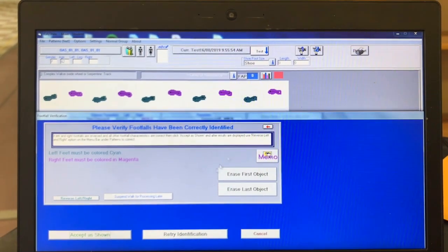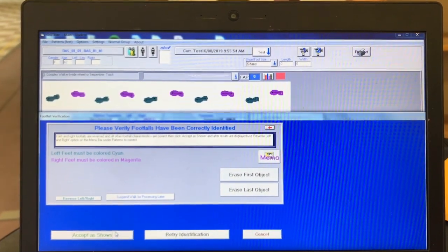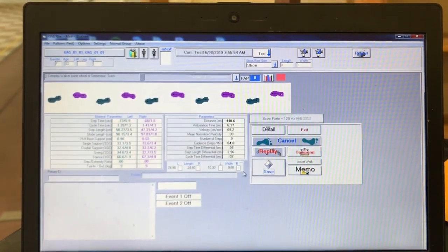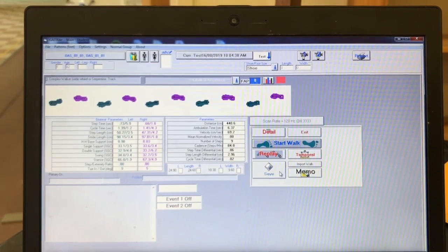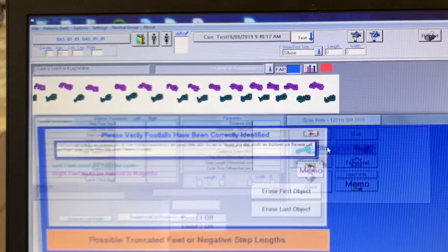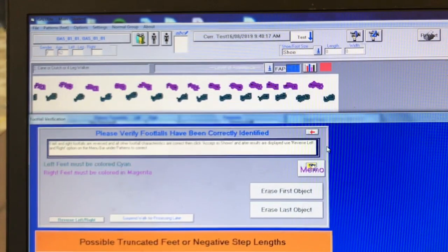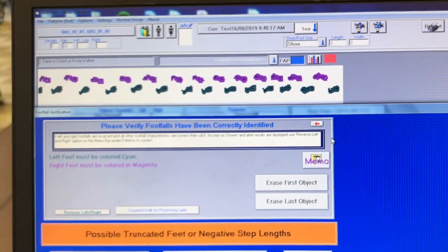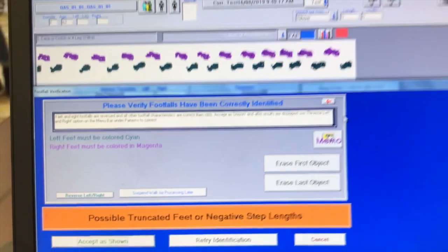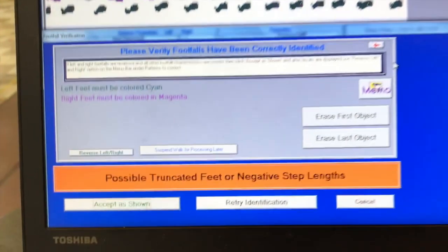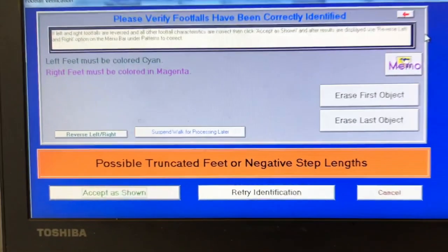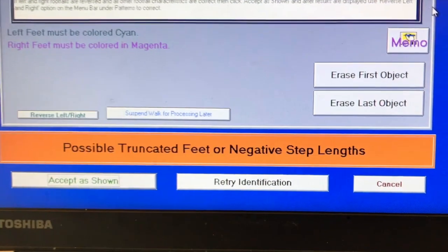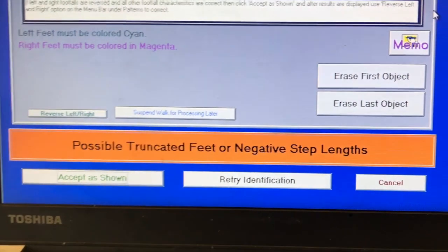Once you click accept as shown or the suspend walk for processing later, you will be taken back to the earlier screen where you will click the save button. If the footprints need to be reversed, click the box in the lower left of the screen saying reverse left slash right and then click retry identification. Sometimes an orange error bar will appear below the footprints. If this occurs during data collection, click the box saying suspend walk for processing later. We will address how to fix these errors in another video called gate right troubleshooting.